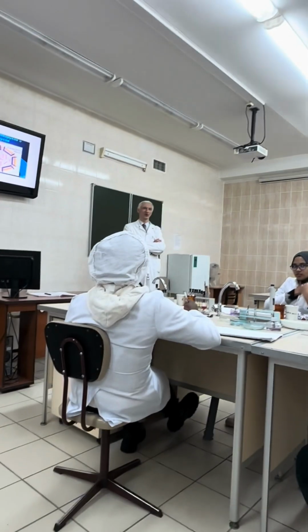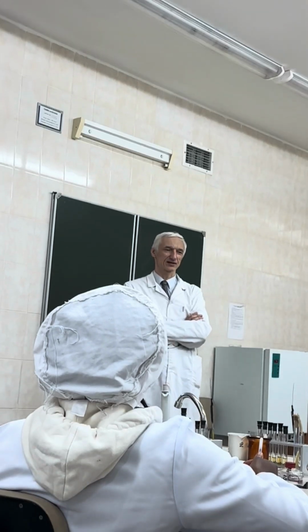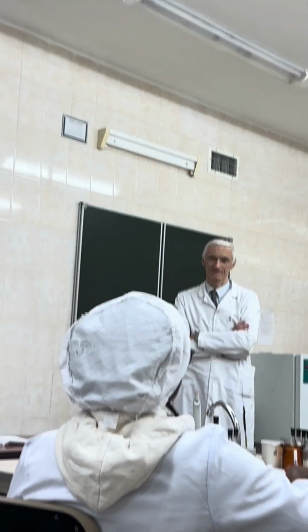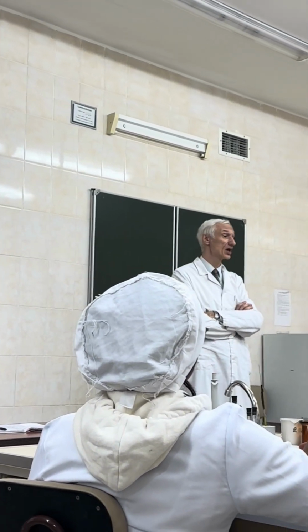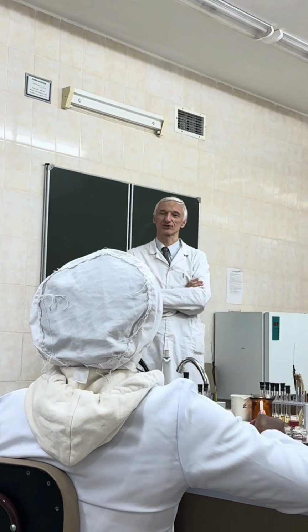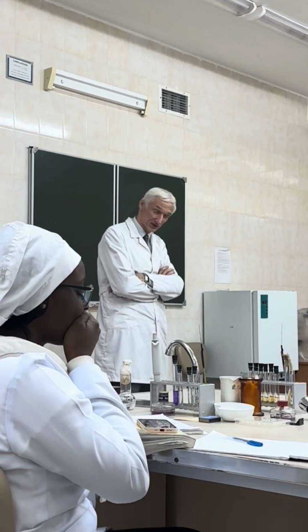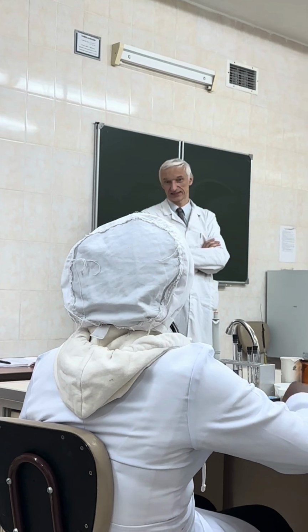Not even from early childhood, it is even earlier. Is this test, ELISA test, homogeneous or heterogeneous? Heterogeneous. What is the synonym for heterogeneous test? Equivalent to what? People, solid phase, let's say.